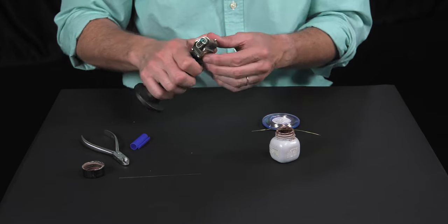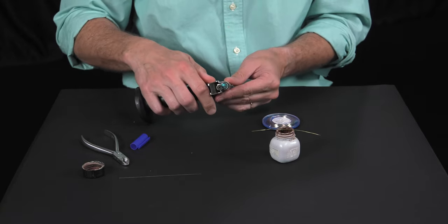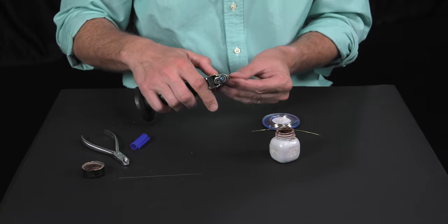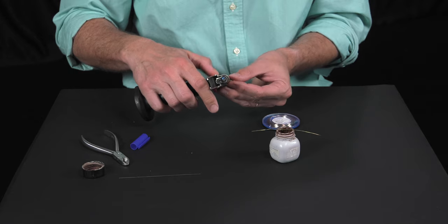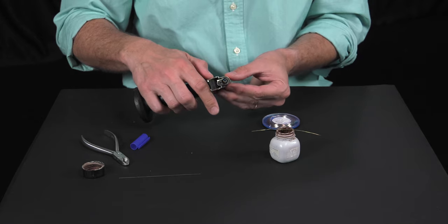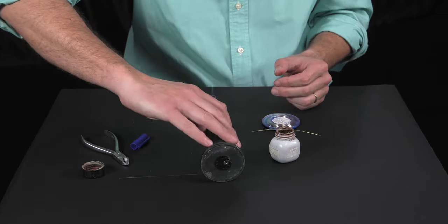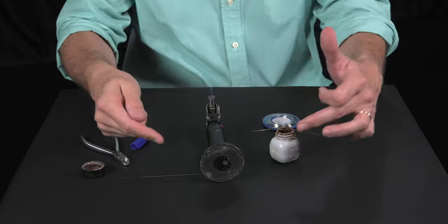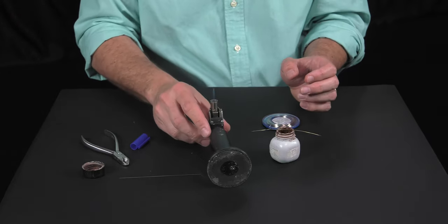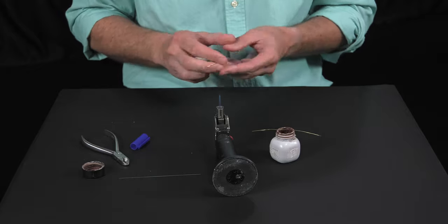We take the torch. We must have a model that can rest on the table and remain vertical and stable during the soldering process.